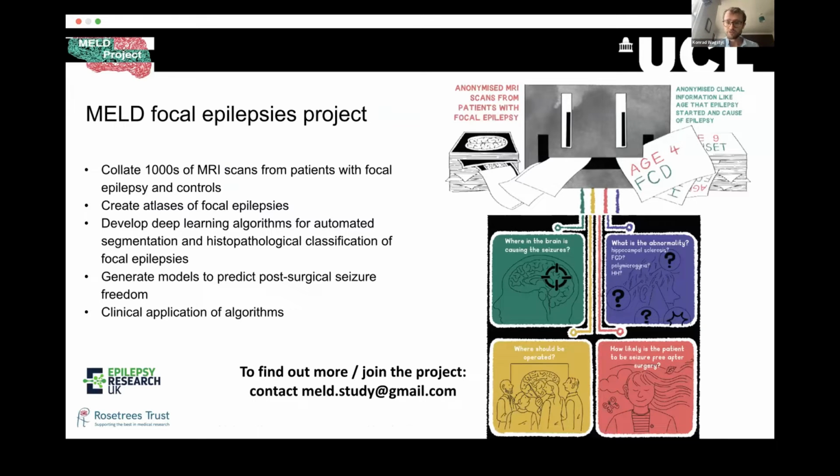FCD is one cause of MRI negative focal epilepsy. There are others like HS, polymicrogyria. And when you have an MRI negative focal epilepsy, you don't always know what you're looking for. And so the aim of the MELD Focal Epilepsies project, which is our new project, is to collect a wider variety of histologies, but also the MRI scans. And so the two things we're trying to do with this is be able to detect the wider variety of pathologies. And the second is to say, if there's what was considered a false positive, it doesn't overlap the lesion mask, we can go back and see whether that is in fact a false positive or something that was missed or some other kind of imaging abnormality.